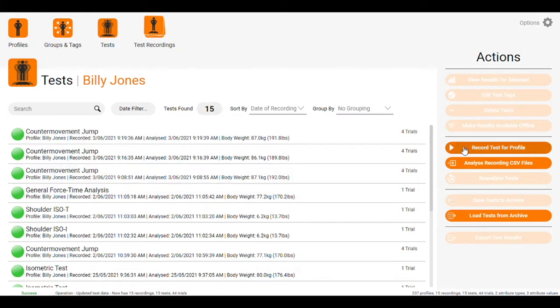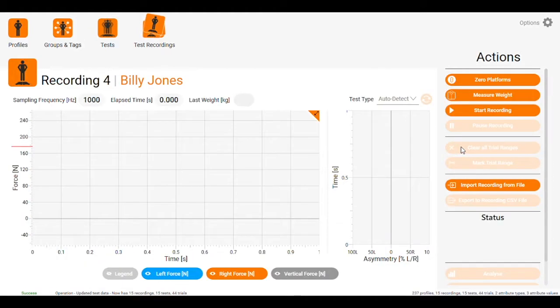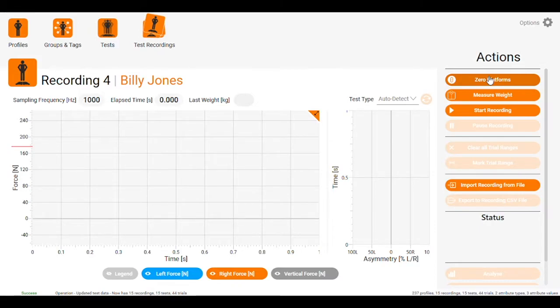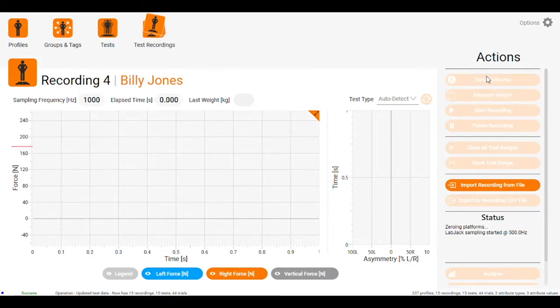From there, we go record tests for profile. The first thing we need to do is zero platform. We come up to the top right there, click zero platforms.